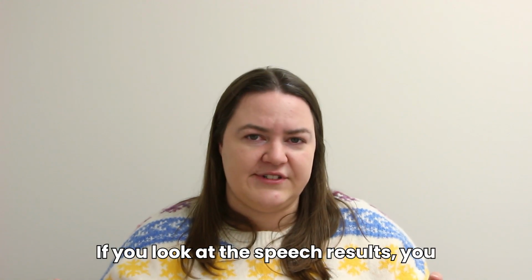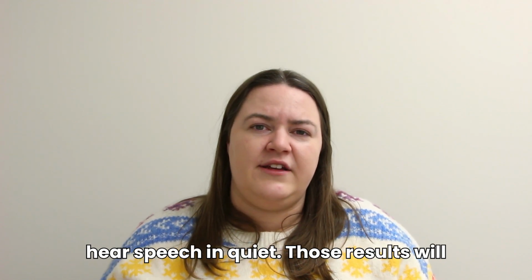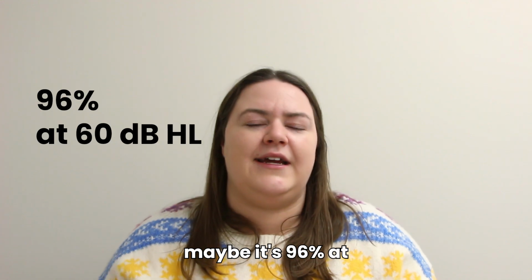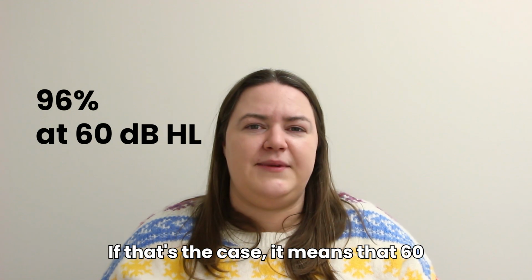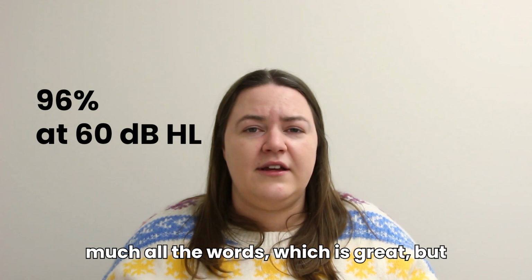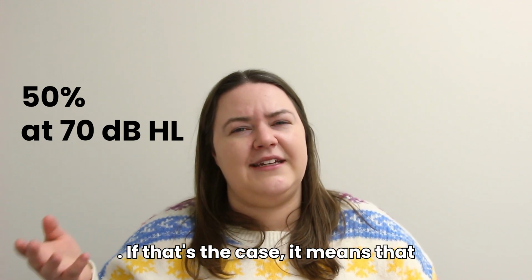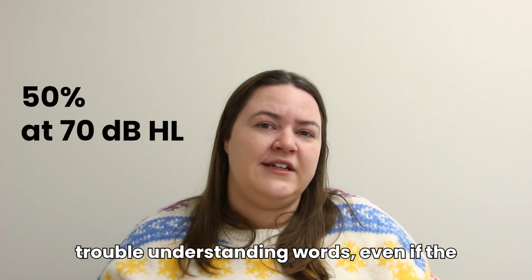If you look at the speech results, you should be able to see how well you could hear speech in quiet. Those results will look something like a percentage at a certain decibel level. So for instance, maybe it's 96% at 60 decibels. If that's the case, it means at 60 decibels, you could repeat back pretty much all the words, which is great. But you might see something else. You might see 50% at 70 dB. If that's the case, it means that even in a quiet room, you're having trouble understanding words, even if the volume's been increased.